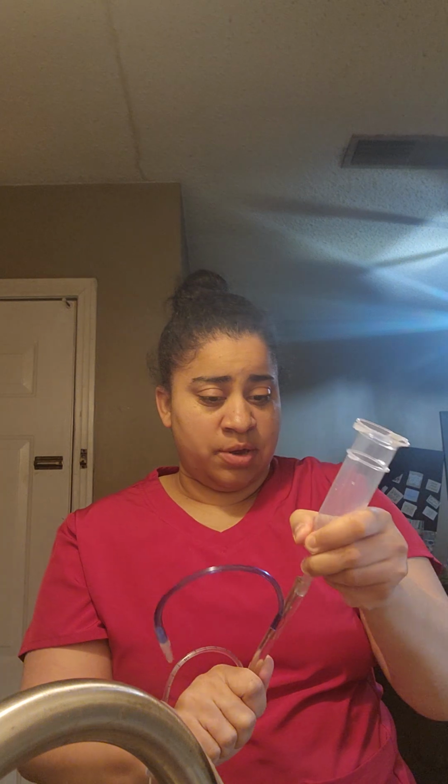Alright, I have flushed it. I'll put it there. I will go ahead and clamp this back. And if I have to do any continuation, I will come back within 1 or 2 hours for the patient.